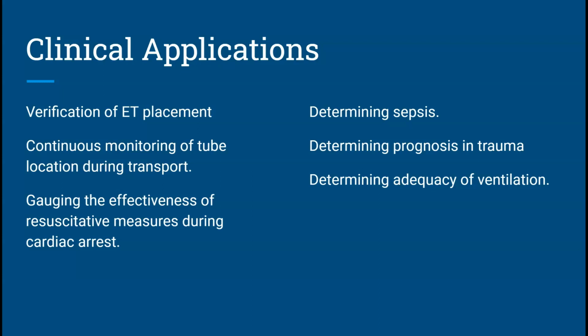The one thing that we most primarily use end tidal for is to verify an endotracheal tube. Not only are we verifying that you are in fact in the lungs, but you're also making sure that it stays there, right? So if all of a sudden you start to have a weird tracing, a weird waveform, you might have displaced your tube, or you might have somehow accidentally pushed it in and you only have the right main stem, or you might have a mucus plug.